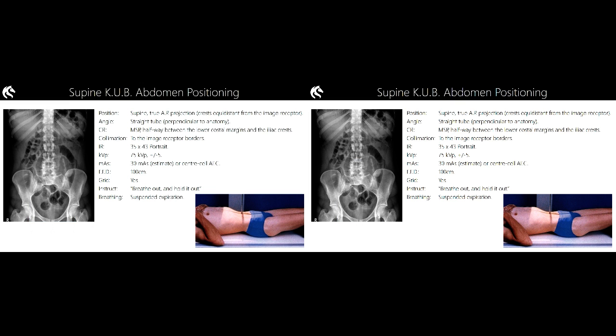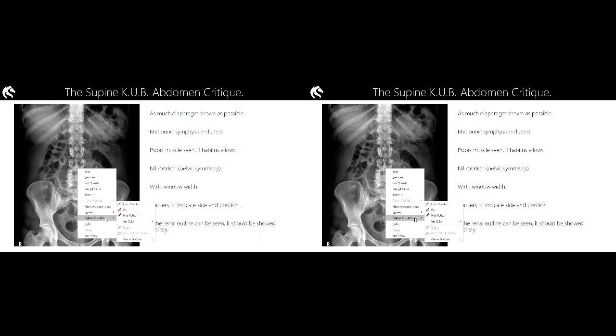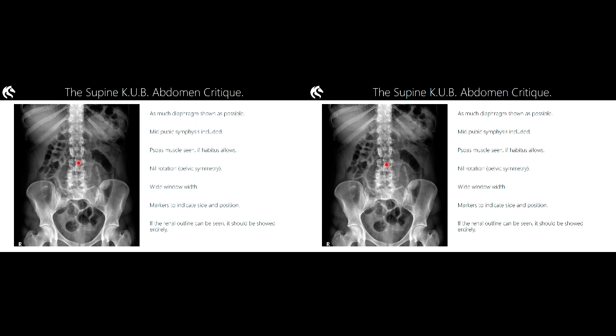It should look, well, that's exactly the same criteria radiograph for the KUB as I have used for the abdomen. So once again, our statements such as making sure that you include about half of the pubic symphysis or to the curvature of the obturator foramen, show as much of the diaphragm as you can, but recognising that it will often be cut off, and to check your rotation by things such as pelvic symmetry and symmetry of bilateral structures, and also things like making sure that your spinous processes are in the middle of your vertebral bodies.